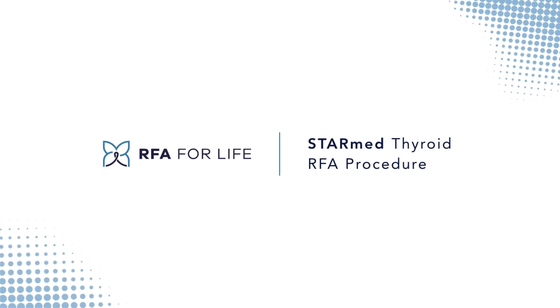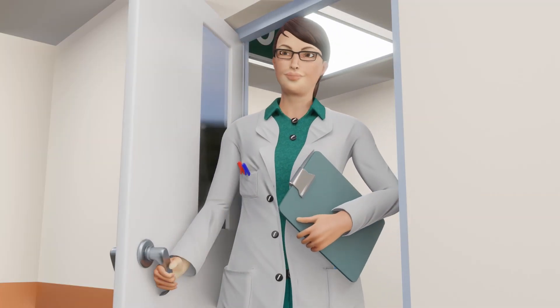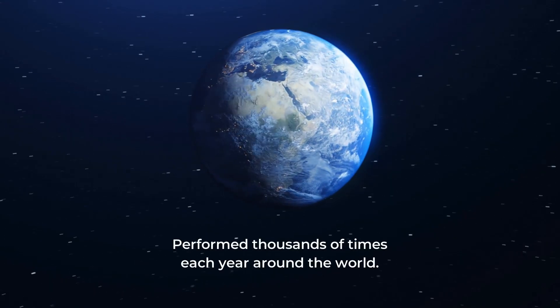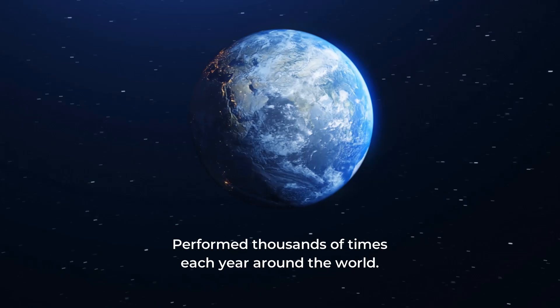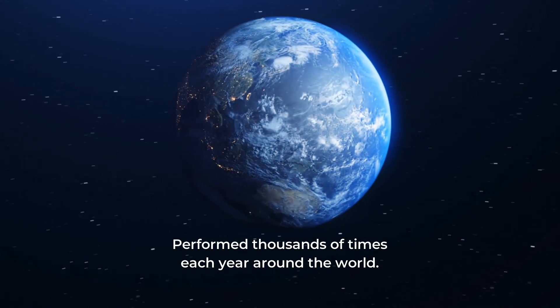This video has been designed to help you understand your StarMed Thyroid Radiofrequency Ablation RFA procedure. We will focus on what to expect on the day of your procedure. StarMed Thyroid RFA is a relatively common procedure performed thousands of times each year around the world.